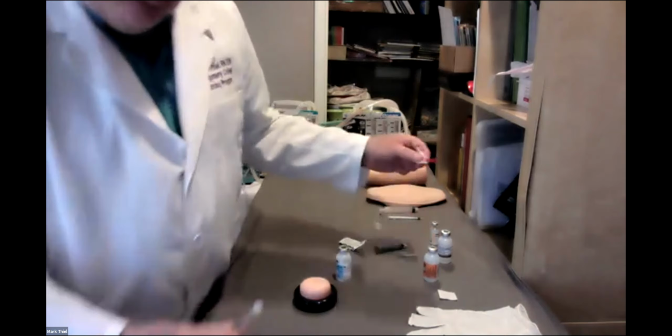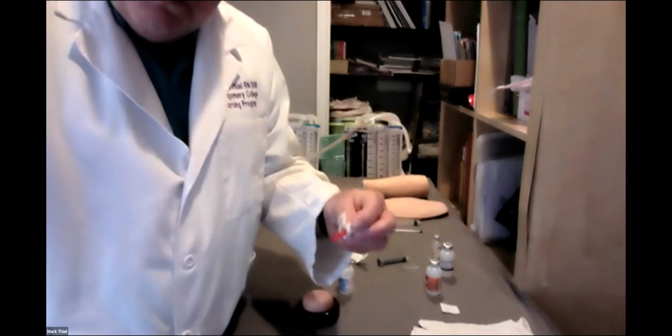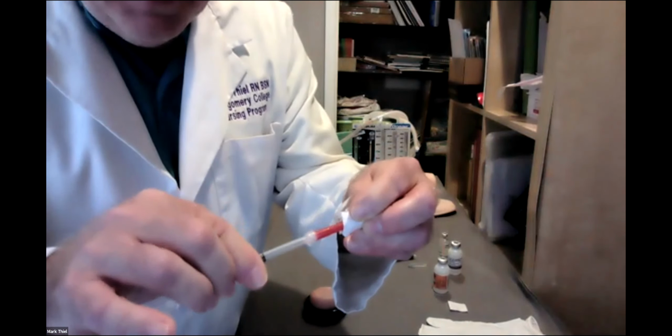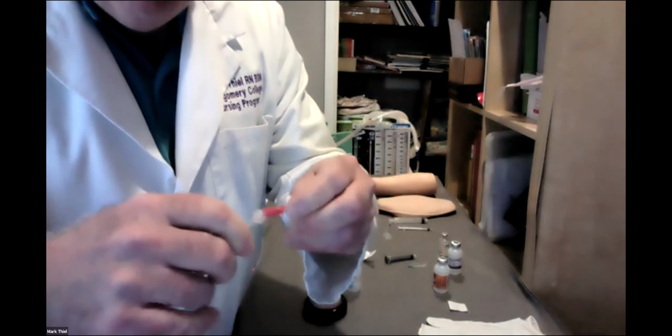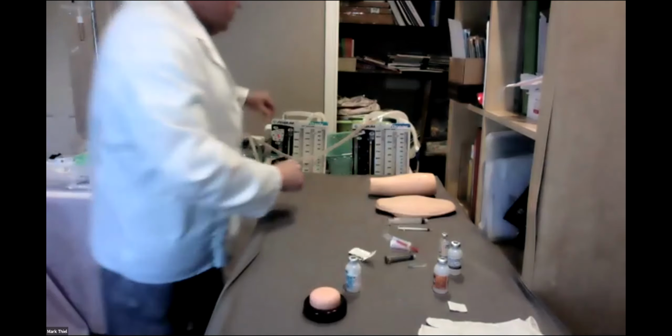What did we talk about before with the intramuscular only? Here's my red blunt. Once again, repeating myself, never ever to utilize. I apologize. One moment.